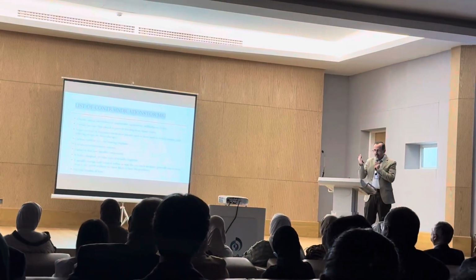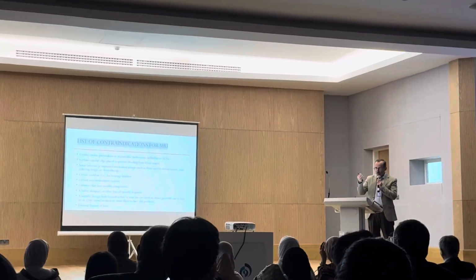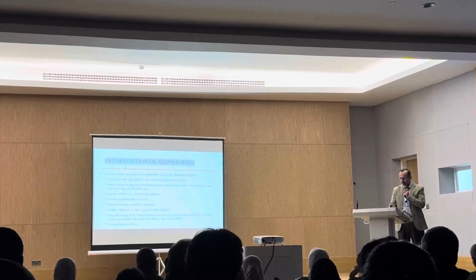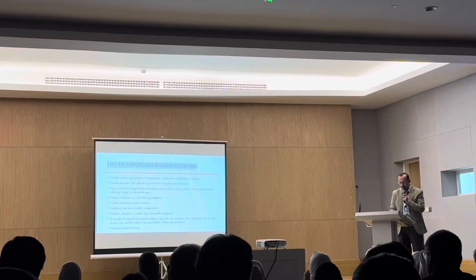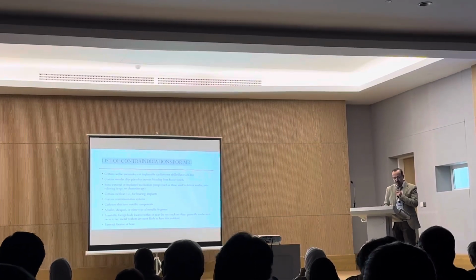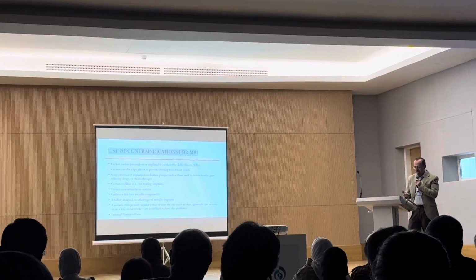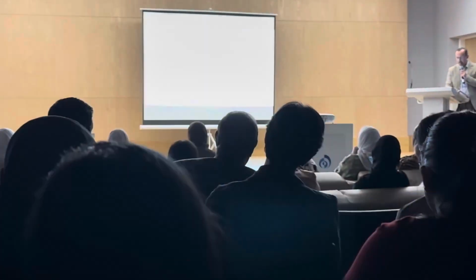One is certain and absolute contraindications, which apply to each age group. From these are the pacemaker, implanted defibrillators, vascular clips, implanted medication pumps, cochlear implants, neurostimulators, catheters with metal, bullets, shrapnel, metallic fragments, metallic foreign bodies, and external fixation.